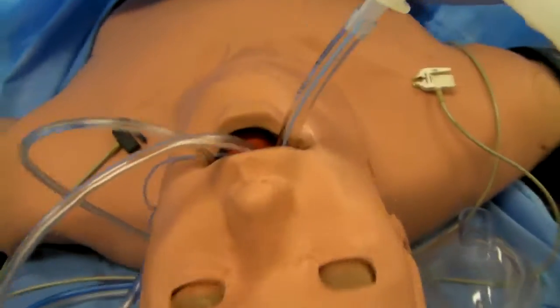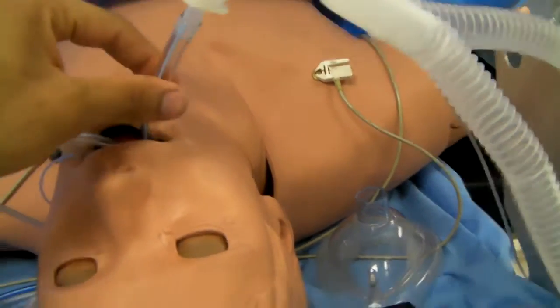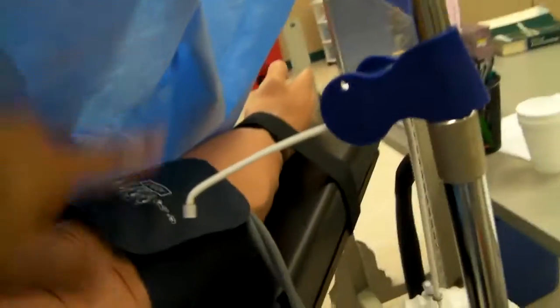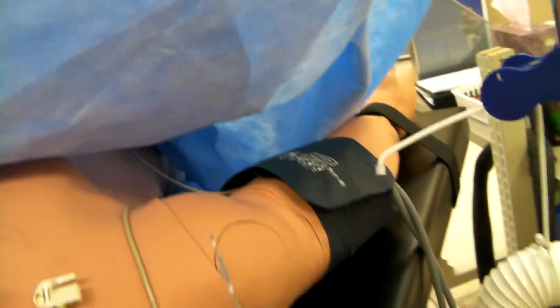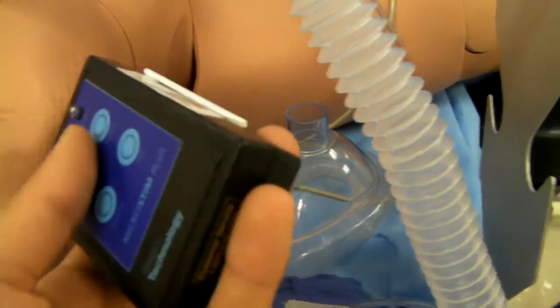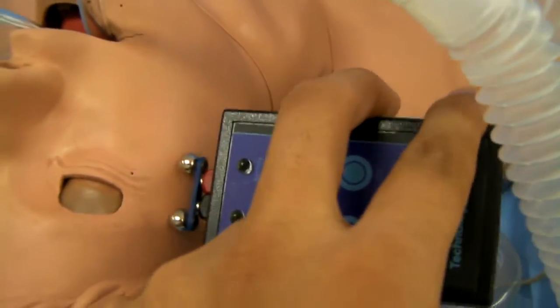What I have to do is a lot of things, but essentially you have to intubate him, put these other tubes in, put on the EKG, put on this pulse ox, make sure his fluids are running, and the blood pressure cuff. This is a neuromuscular monitor, to see how much paralysis you've given the patient, based on how much they twitch once you give them electrical stimulus right there.